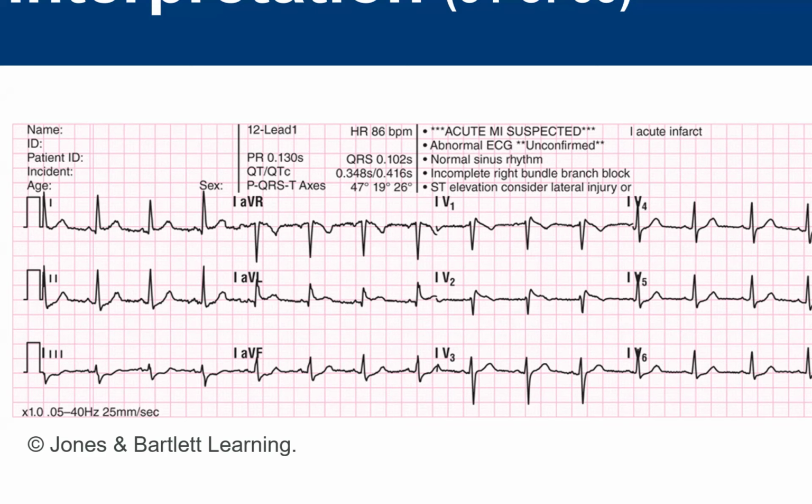Okay. Just based on lead 2, it looks pretty normal. Lead 3 looks a little off, a little bit of axis deviation there. We don't know what that is yet. We'll come back to that. But look at lead 1 and 2. Do we have P waves? Do we have QRSs? T waves? PRIs look equal and normal? RRs look regular? What are we in?